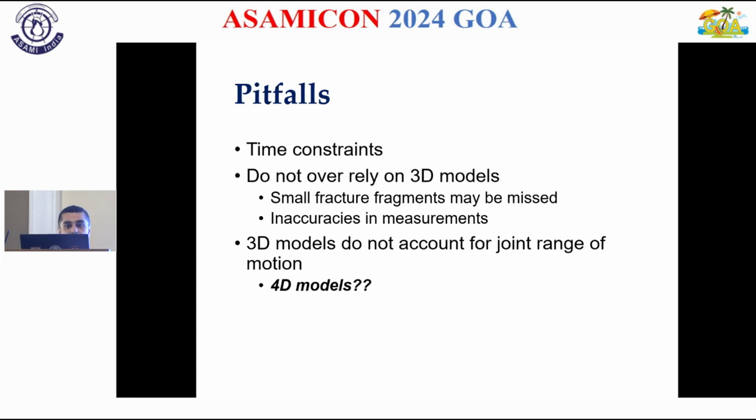So the pearls, we all know that you need to learn segmentation. You need the actual CT data. The pitfalls is that it does take time. There is a learning curve. Do not rely on 3D models because sometimes the measurements can be off. And if you are modeling a fracture, the fracture fragments can be lost.